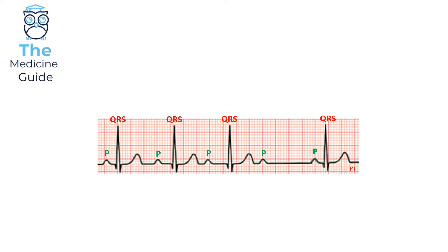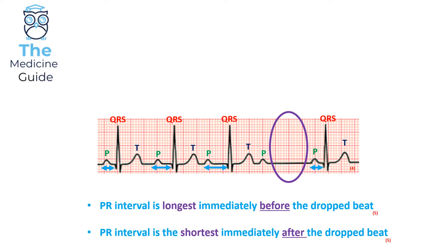I also like to identify the T waves and then look at the PR interval. Hopefully you can appreciate that the PR interval is becoming progressively longer until we reach the fourth P wave, where the QRS complex is in fact missing. And then the next PR interval afterwards is very, very short. These are two key points used to identify this particular type of heart block: the PR interval is longest immediately before the dropped beat, and shortest immediately after the dropped beat.